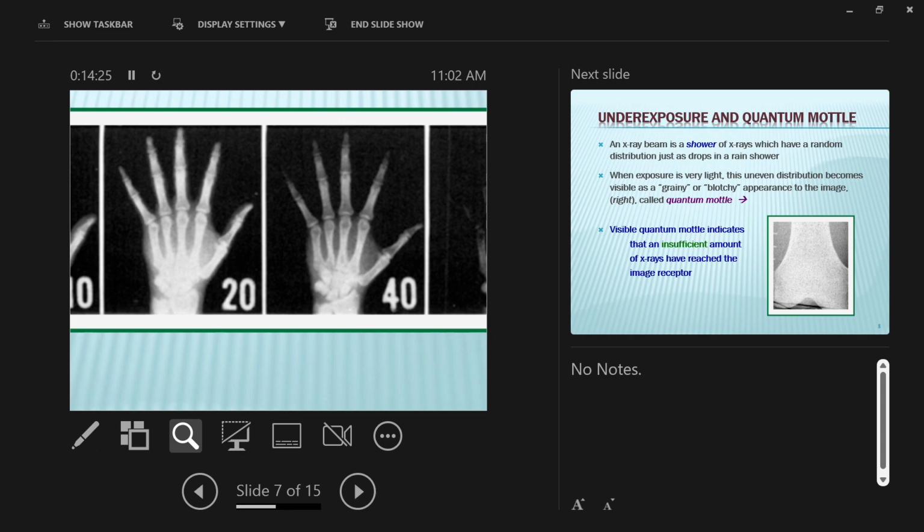Notice the carpal bones are now more visible because they've changed brightness. Notice I didn't change the shape of anything. Recognizability has not changed. This and that are just as recognizable, but now they're more visible in this one. I can see carpal bones now where I couldn't see them before.